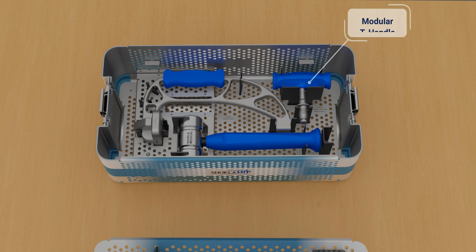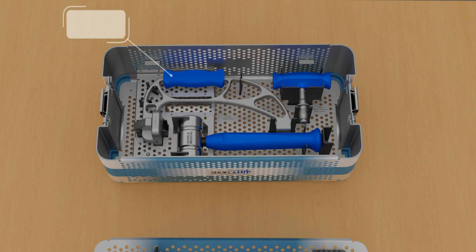The modular T-handle is used for additional grip on the strike plate frame during the extraction process. The strike plate frame allows extraction of the hip stem. The mallet allows for optimal extraction force on the strike plate frame.